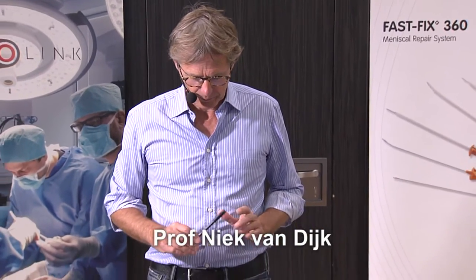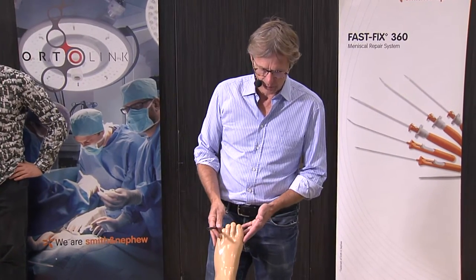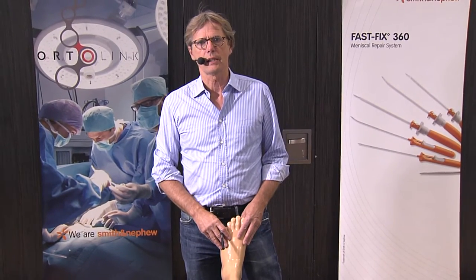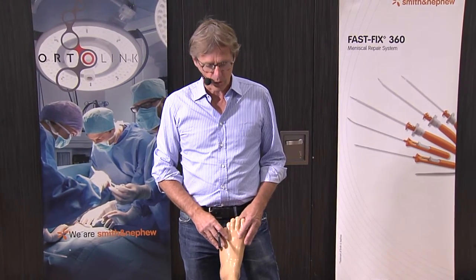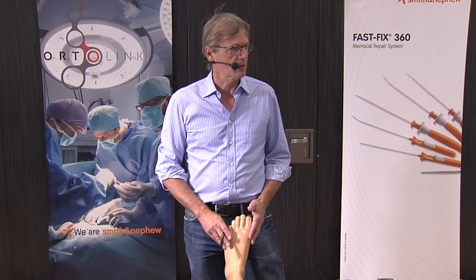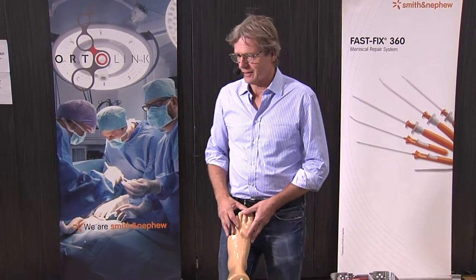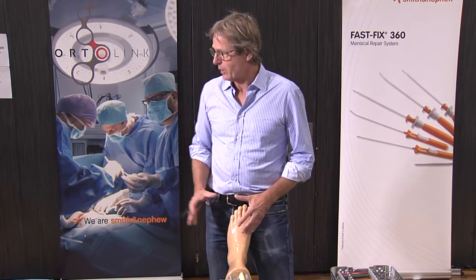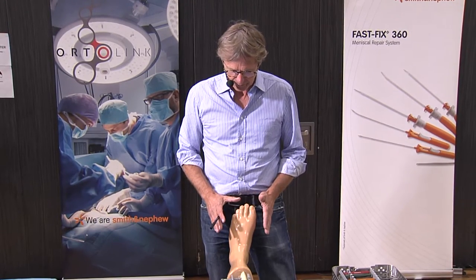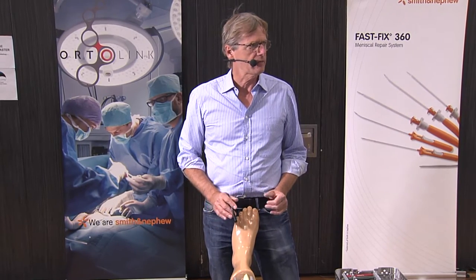Let's start. We have an ankle in front of us — it's a model of an ankle and it's a sole bone, so it will be interesting to see what's inside. I never did an arthroscopy on a sole bone, so for me it's also interesting to know if there is a joint inside. Leo has assured me that there is, and so we will see. The basics we can teach on a model, probably even better than on a cadaver.